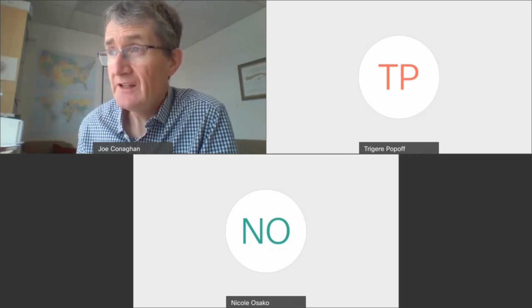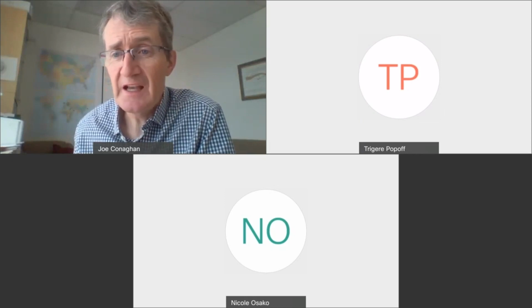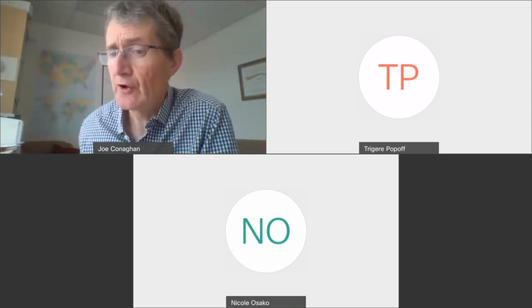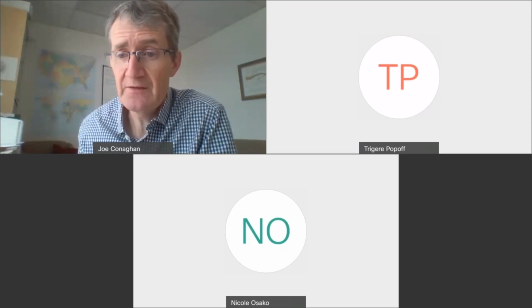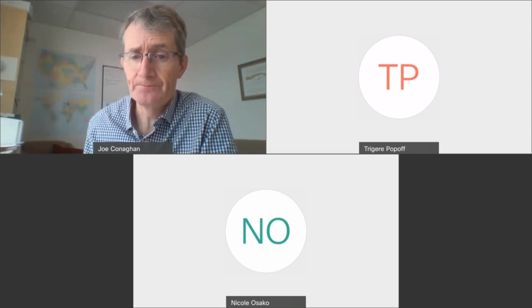Right? Now, if you leave them in there longer, it's possible that you're not going to see any obvious effects from this, but really, as you continue to vitrify and move forward, you can refine your skills, you can hone your time, and you can get doing these procedures much quicker and much faster. And it saves you time too, and it saves the embryo or egg from sitting in the cryoprotectant solutions for longer than necessary.